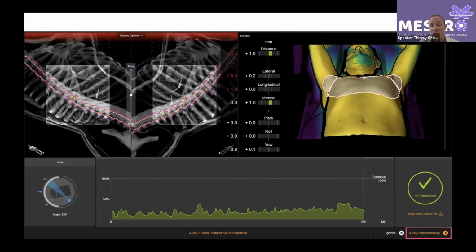We just started, but I wanted to show that for spine radiosurgery, we go for 24 gray in 2 fractions. We also apply that kind of strategy: we apply motion management with the surface, but we also apply X-ray images to see whether or not our patient is at the right spot. So that's the idea.